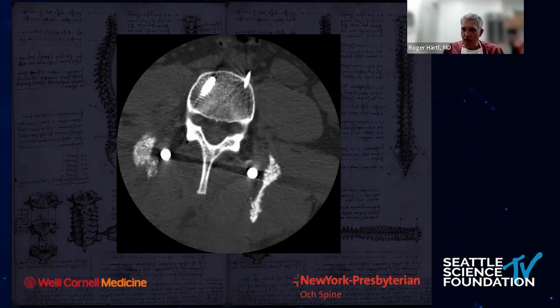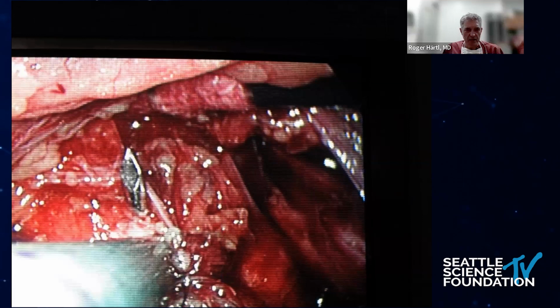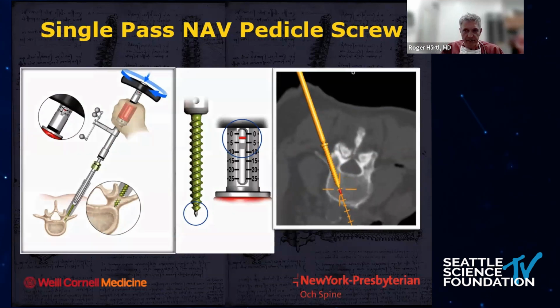I used to use K-wires maybe 10, 15 years ago, until I had a bunch of imaging studies that looked like this, where the K-wire broke off, and then we had to go back in with a laparoscopic surgeon to fish out the K-wire. So I really tried to get away from K-wires, and there are companies now that make these single-step MIS pedicle screw systems that you can navigate, that work really nicely. We've been using these maybe for 5 or 6 years now, very, very successfully.